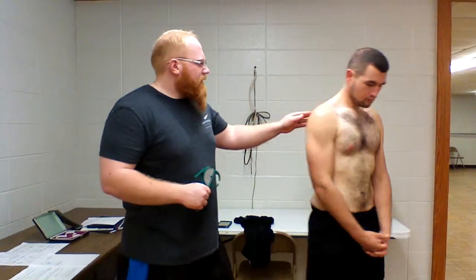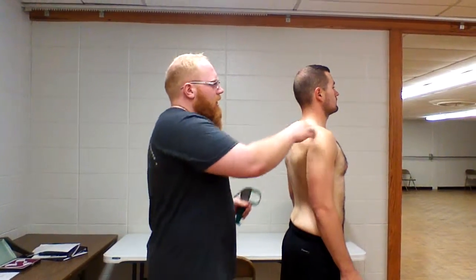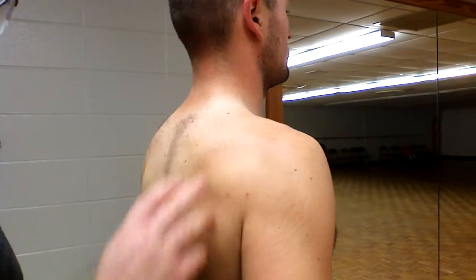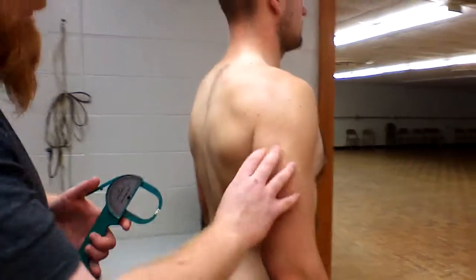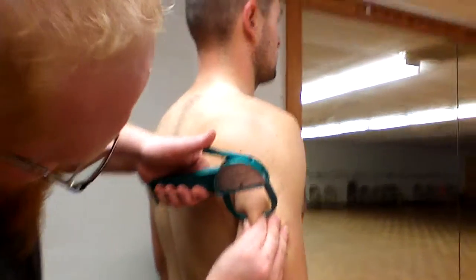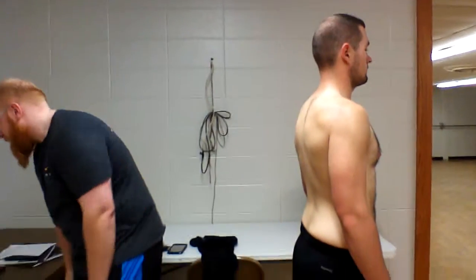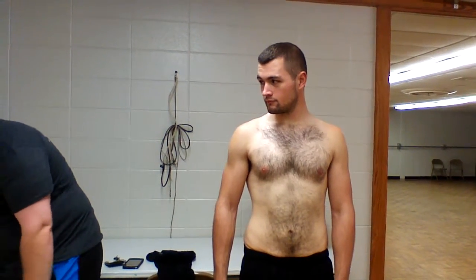So we're going to start at the triceps. The triceps is a vertical fold. Make sure their arm is hanging loosely. With triceps, you want to go right between the acromion process, which is right here above their shoulder, and the olecranon process, which is essentially the elbow. So you want to be right in between, vertical fold. You want to read the number as soon as you pinch it, which is right at 15, and then mark it down. It's 15.